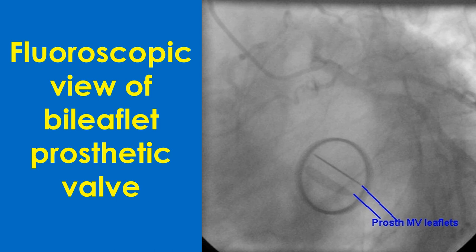Though prosthetic valves are seen well on chest X-ray, they can be evaluated better by fluoroscopy. In fluoroscopy, valve leaflets which are radiopaque can be seen opening and closing at the corresponding time of the cardiac cycle depending on the position of the valve. A stuck leaflet can be easily identified. A fluoroscopic view of a bi-leaflet mitral valve is shown here with leaflets in the open position.